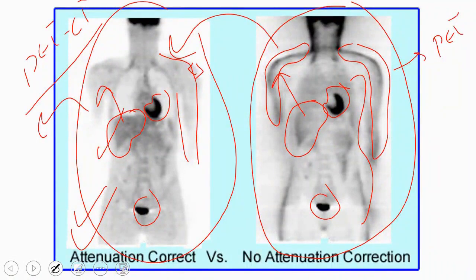Anywhere. This is the function of the CT, to provide a fusion between the PET image and the CT image, utilizing the biodistribution of the activity in the radioactive material, while simultaneously benefiting from the CT image to precisely locate the radioactive material.